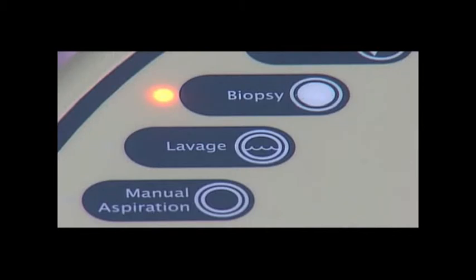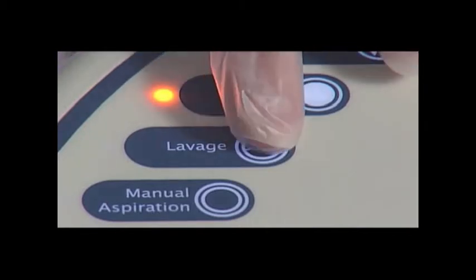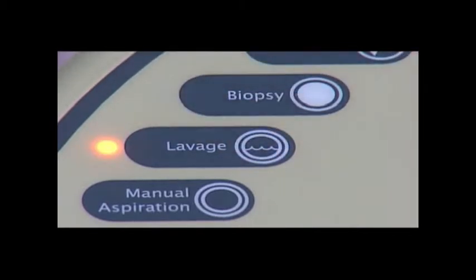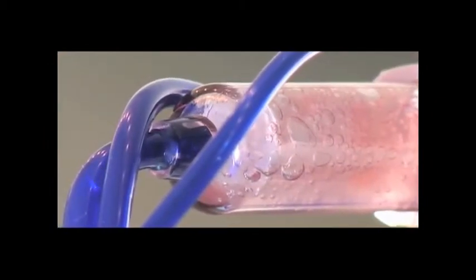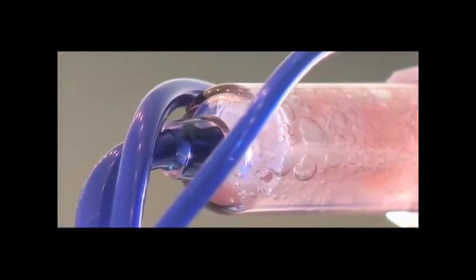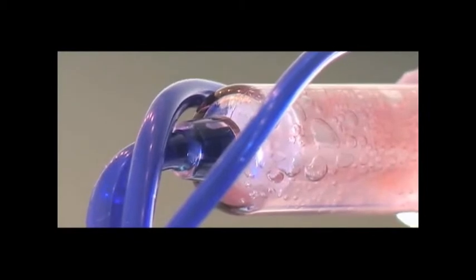After tissue acquisition is complete, switch the console to lavage mode by pressing the button marked Lavage. Lavage continuously irrigates and aspirates the biopsy cavity, allowing loose tissue and other fluids to be cleared from the biopsy site. Lavage the cavity until the fluid collected in the tissue collection chamber indicates the cavity is clear.